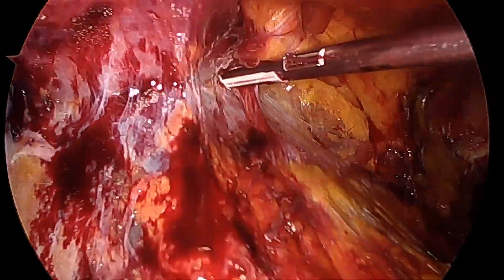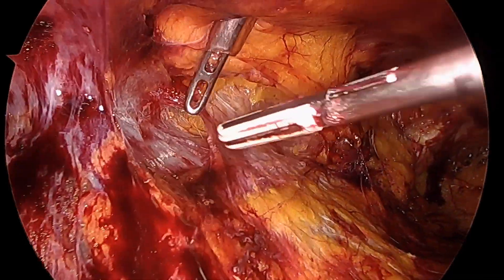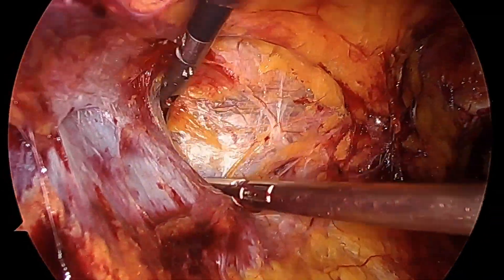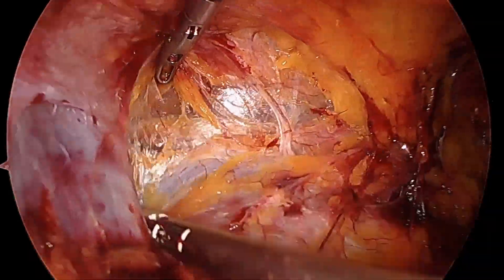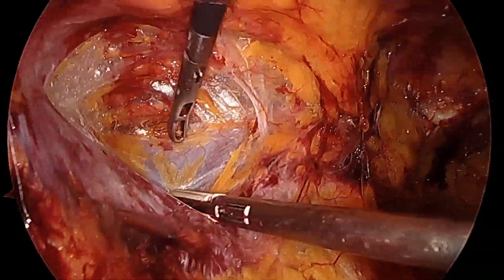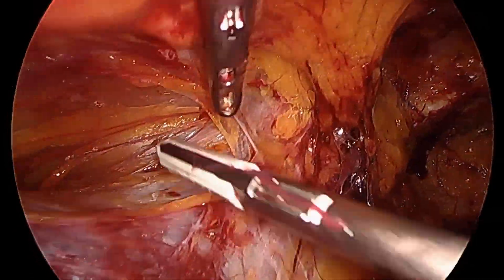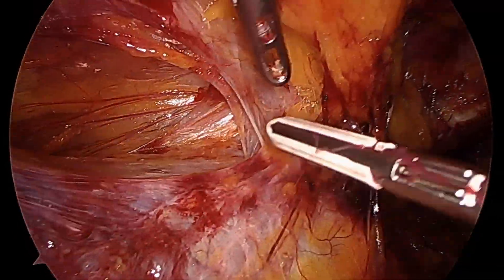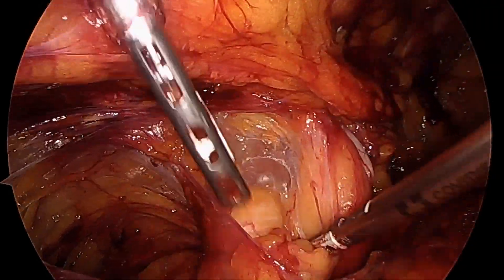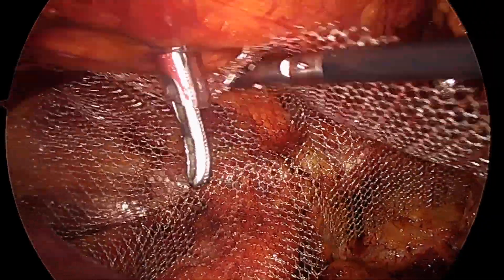Now we're going to do the same thing on the right side. Here I left unedited this part where you can see the transversalis fascia inserting on the lateral edge of the rectus. We're cutting the transversalis fascia — which will be called the intermediate fascia in this part of the surgery — migrating now into the visceral compartment. Our focus at this time is to stay very close to the peritoneum so all the fat protecting the nerves on the left side of the screen will be left in its rightful place, keeping the nerves out of harm's way.